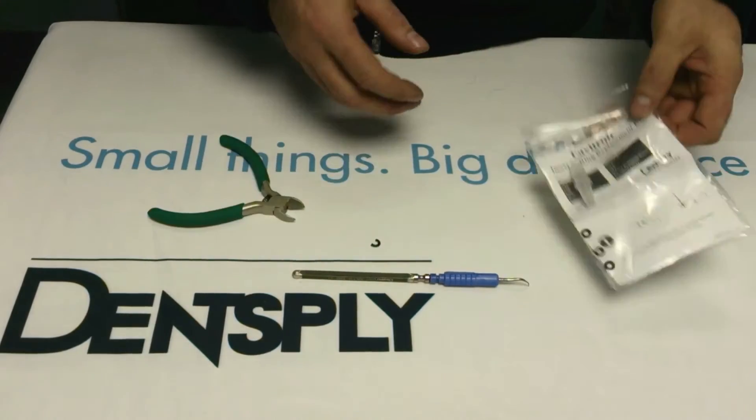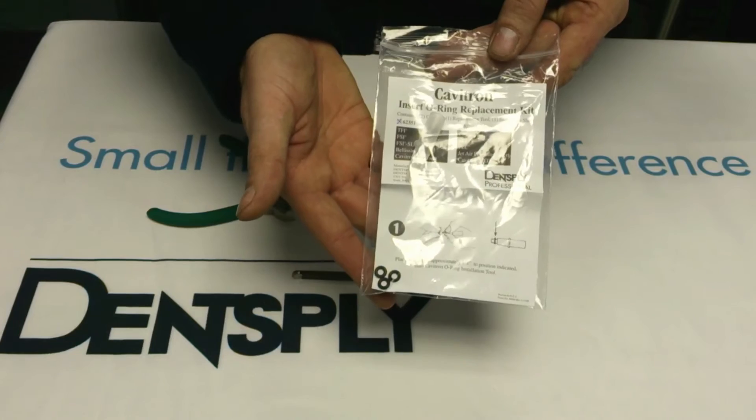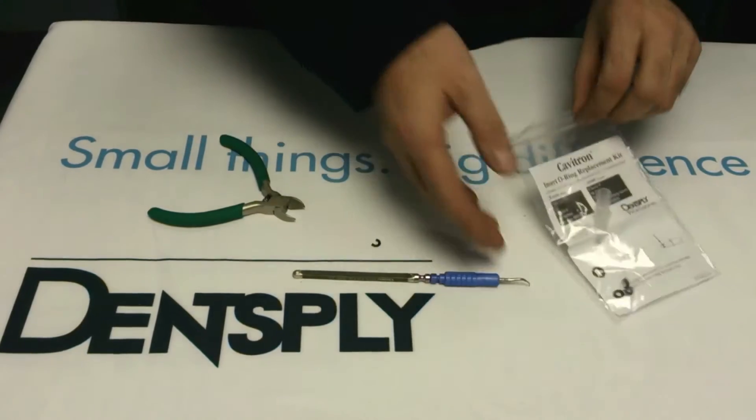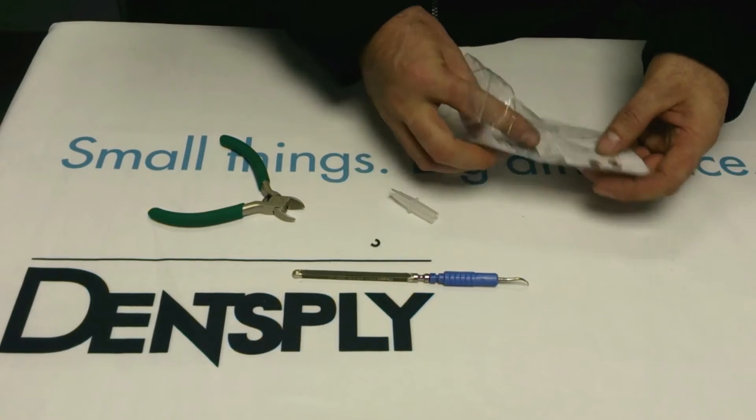To replace the o-ring you need a kit of o-rings like this, which is available from Dent Supply or through the dental dealer chain. It comes with an installation tool and 12 o-rings.